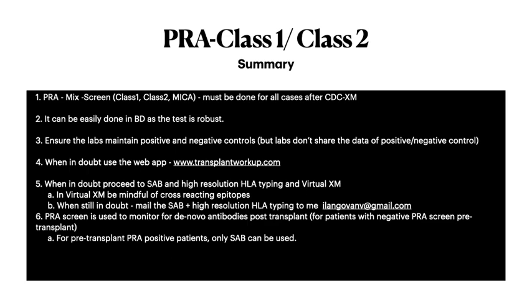For many patients you get both class 1 positive and class 2 positive, but it does not match with flow cross match and CDC cross match. Both are negative, so it doesn't make sense, right? In that case, you have to talk to the lab and tell them that maybe their test is falsely positive. So when in doubt, you can use the applications.